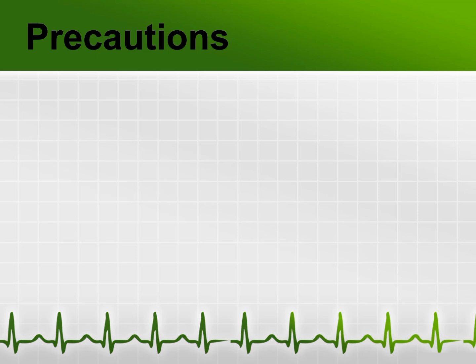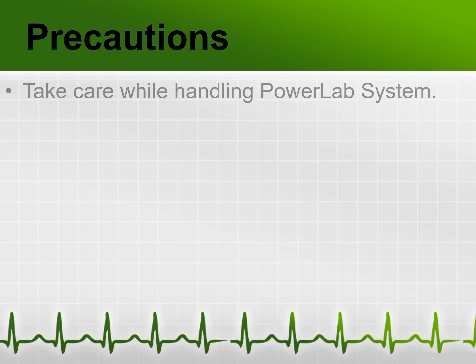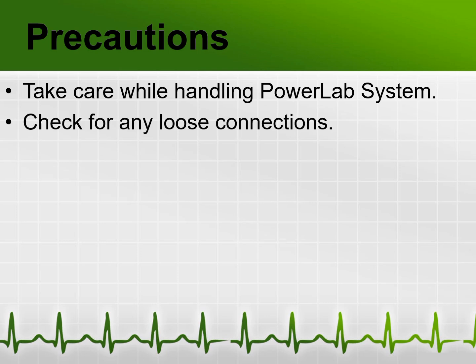What are the precautions? Take care while handling the PowerLab system. Check for any loose connections and electrodes should be placed properly.